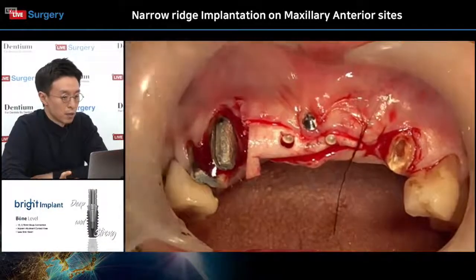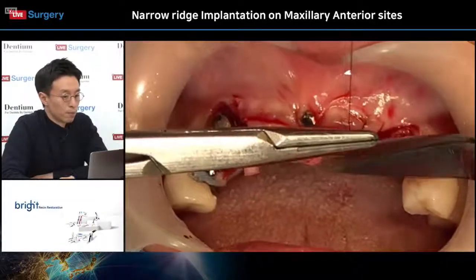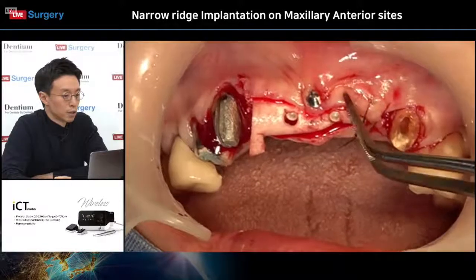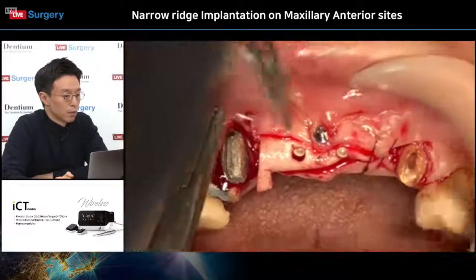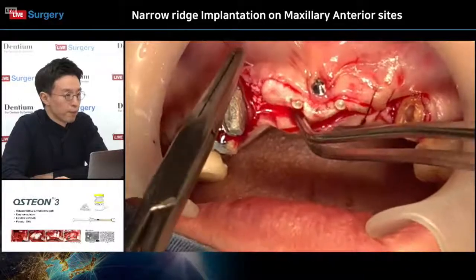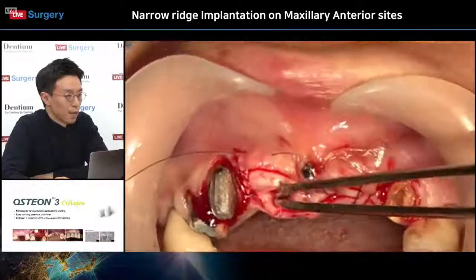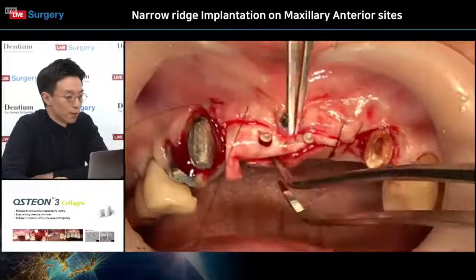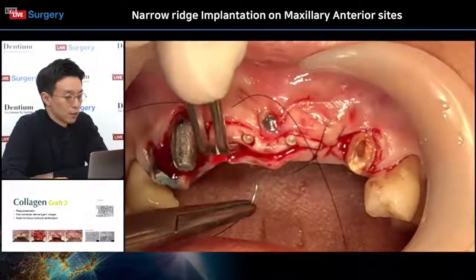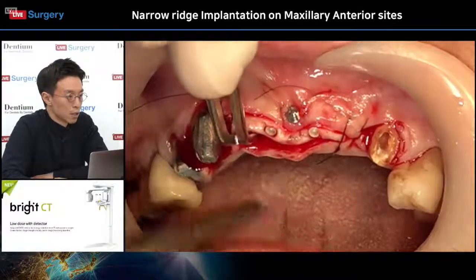Many studies about bone resorption in long-term follow-up stated that the absorption rate of simultaneous particulate graft is approximately 50%. Because of that, I performed the bone graft twice as large as the defect size, considering that it will be absorbed later.